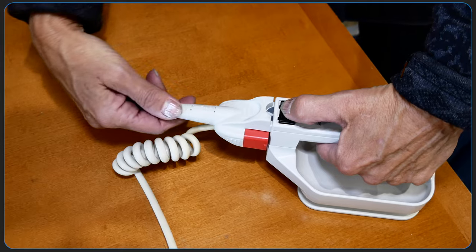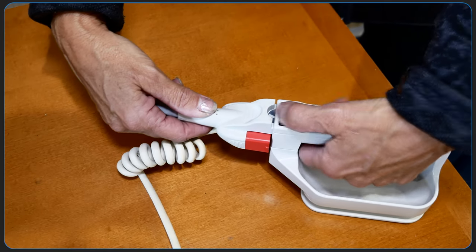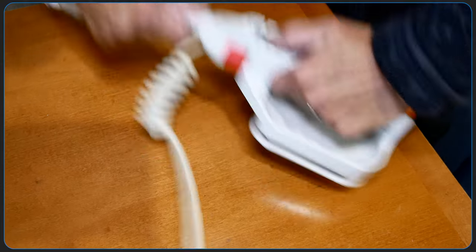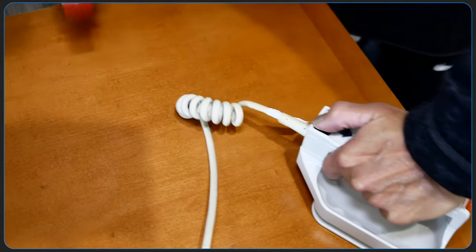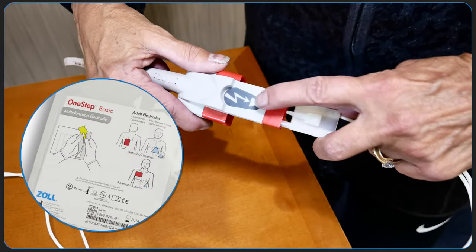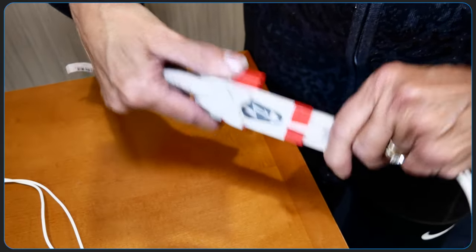To switch from external paddles to therapy electrodes or pads, first remove the one-step cable from the external paddles by pushing on the release button and pulling firmly. To connect the electrode to the one-step cable, push the two connectors together until the latch clicks.